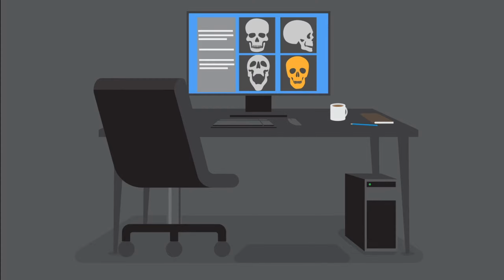For better interpretation, keep the monitor clean and use some darker shades of the desktop background. The extra white lights from the screen will actually make your vision weaker. There you go. Now it's better. If you come to our office, don't assume that we are animals of darkness. We are just trying to read the radiographs better.